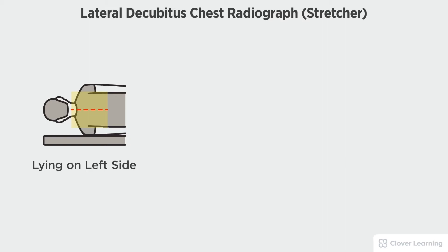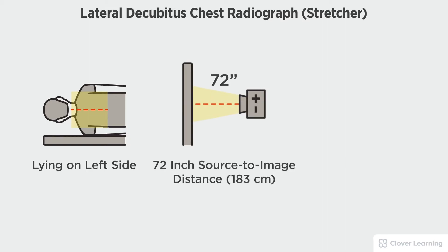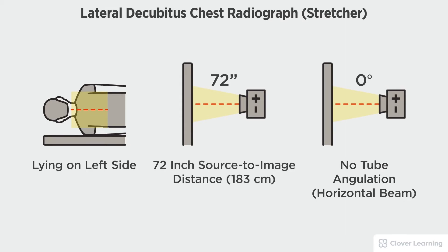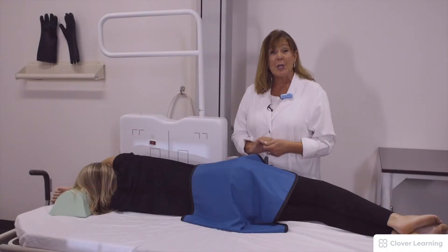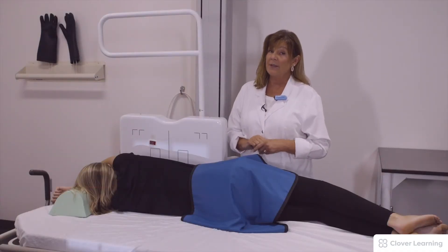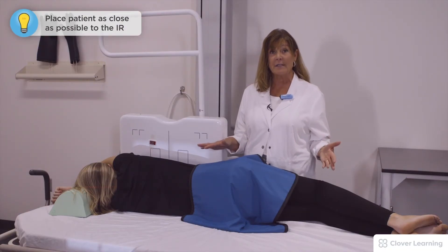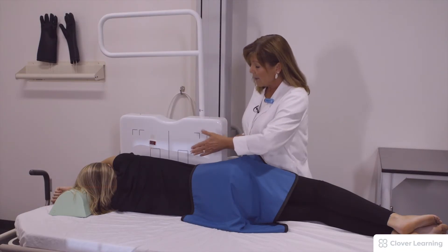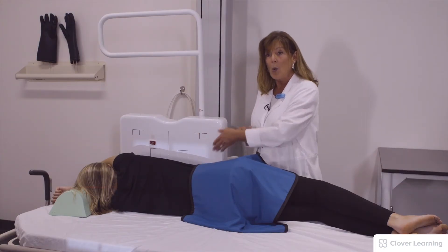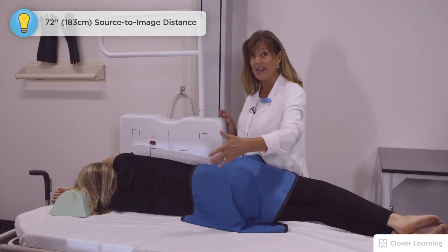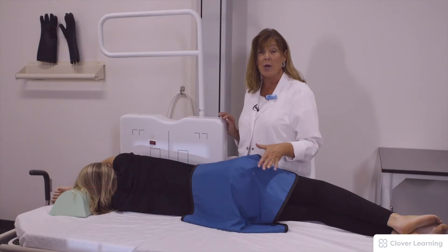In this view we will be demonstrating the lateral decubitus chest. The patient should be lying on their left side, or as dictated by pathological conditions, with a 72-inch source to image distance and a horizontal beam with no tube angulation. For a decubitus chest, our patient is unable to stand. She is on her left side on the stretcher, the stretcher is locked, and we have her rolled up as close as she can get to the IR. We have a 72-inch SID and no angle on the x-ray tube.